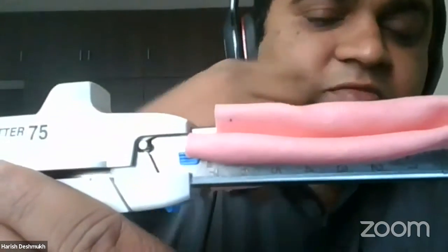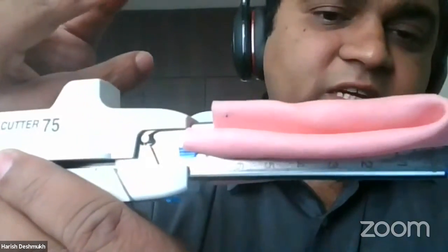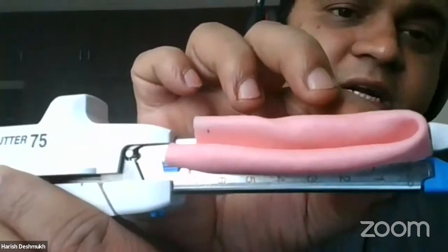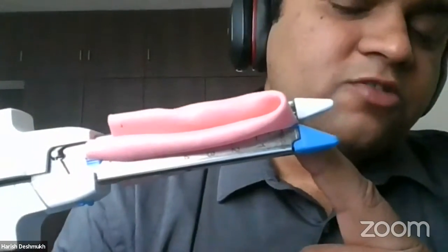Because of its viscoelastic nature, even after waiting for 15 seconds with pre-compression and other things, when you fire it, it will creep out a bit. Because of that creeping out, you will have a little bit of space even after the firing, close to 1 mm or 2 mm max. That tissue creep is there with the open staplers as well.